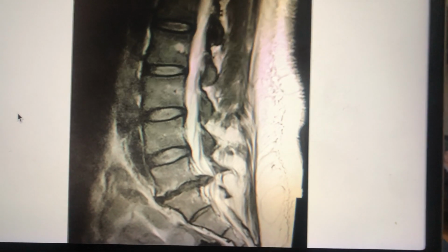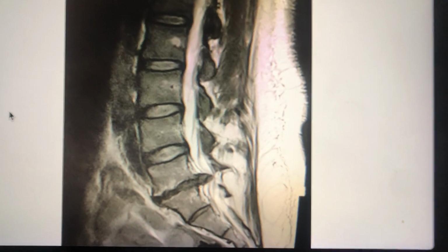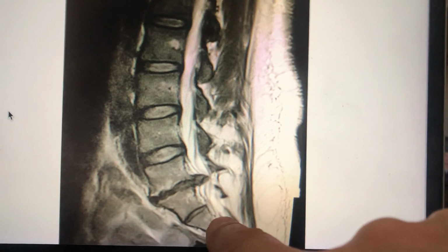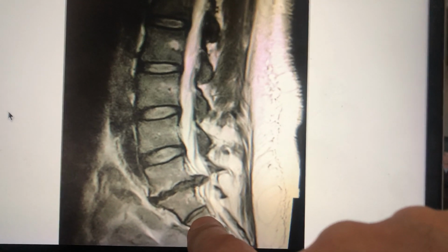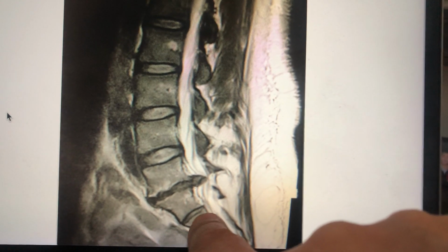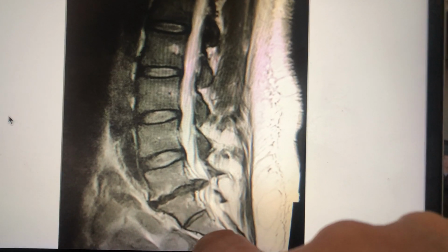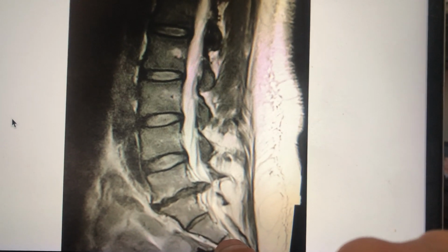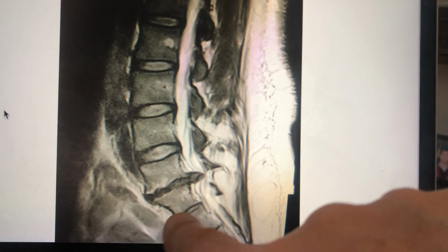Now, when we look at these MRI scans, we have to orient ourselves in terms of the anatomy. The easy way to do it in the lumbar spine is you find the sacrum at the bottom. The sacrum is 5 segments which fuse together. There's very often, as in this case, in fact I'd say usually, a rudimentary disc there, just the vestige of the disc that was there before the sacrum fused in its 5 segments. We call the topmost segment S1. This would be S2, S3 would be down there, and you can't see S4 and S5. Anyway, that's how we orient ourselves in the low back.